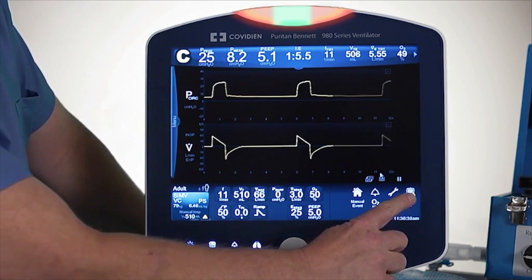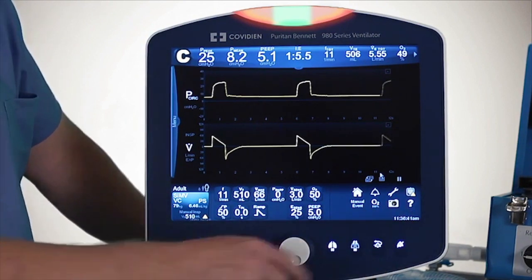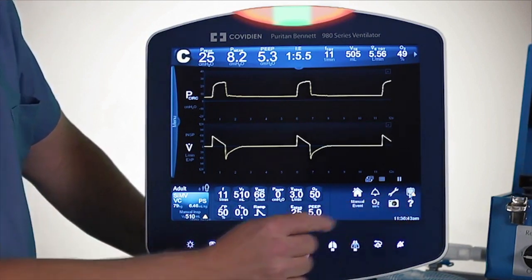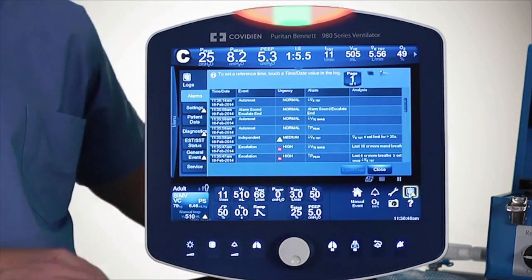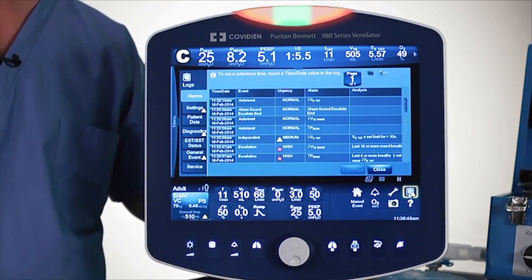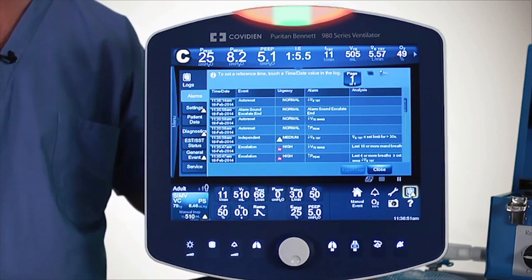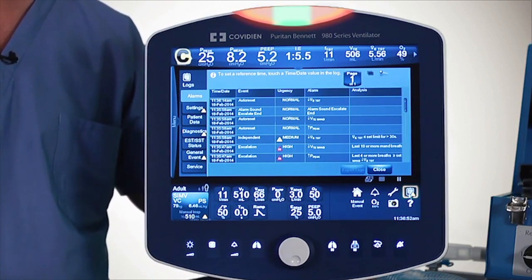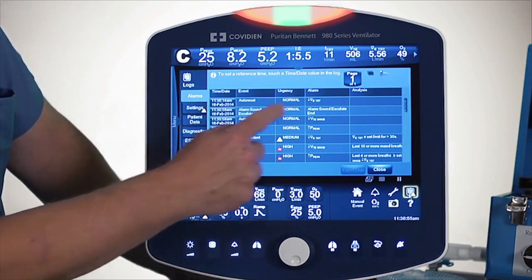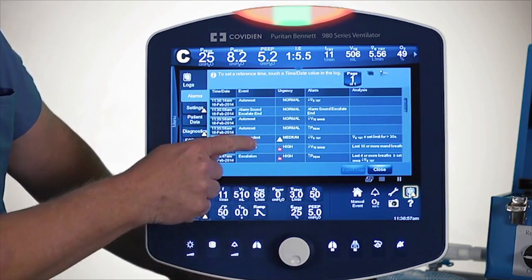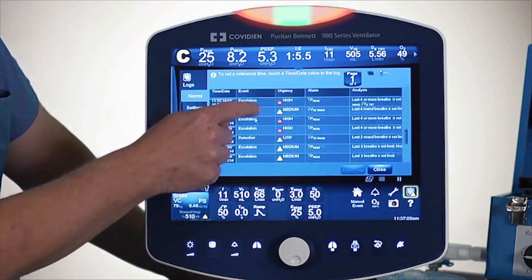Under the icon area there's a little clipboard on the right-hand side. I'm going to touch this log icon, and there are tabs along the left-hand side. The top-left one is the actual alarm log. It will keep 1,000 alarms, so I can look at the last alarm that went off and scroll up to look at a multitude of alarms.